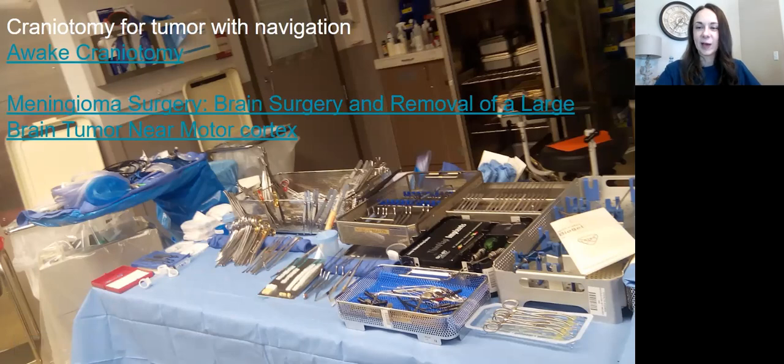That's really it. So I use probably three or four instruments during the craniotomy, like the actual taking the tumor out part. So yes, I have lots of different trays, but very few instruments overall. So after you learn it, it's really not complicated. They might be doing brain surgery, which is complicated, but the tools you have are really not. They're pretty simple. That's why I liked it.